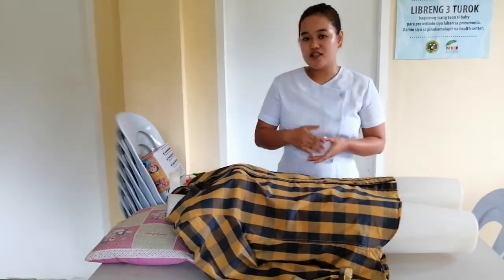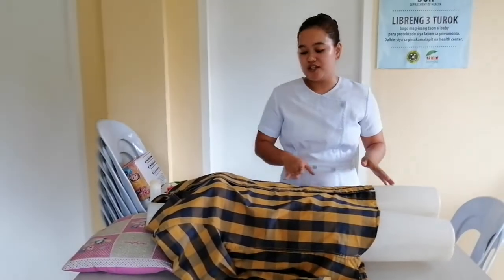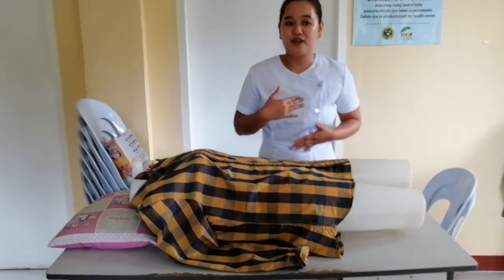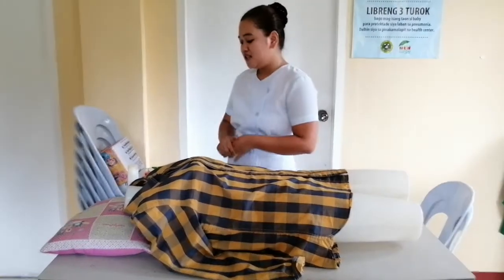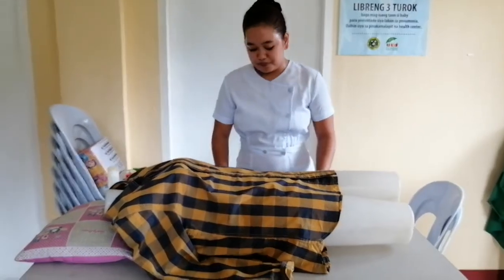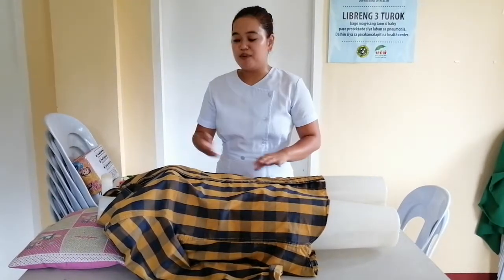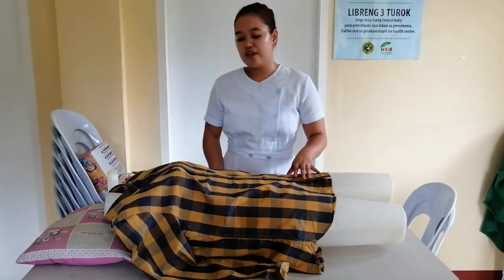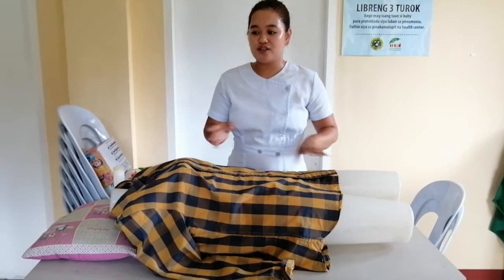Some clients undergo ECG because their doctor prescribed this procedure. Maybe they are suffering from heart conditions or heart failure that may affect the organs. The second step is to keep the client's body away from materials or things that may cause electrical interference, such as equipment and wire cords. Also, materials such as metal, coins, or a watch may cause electrical interference.